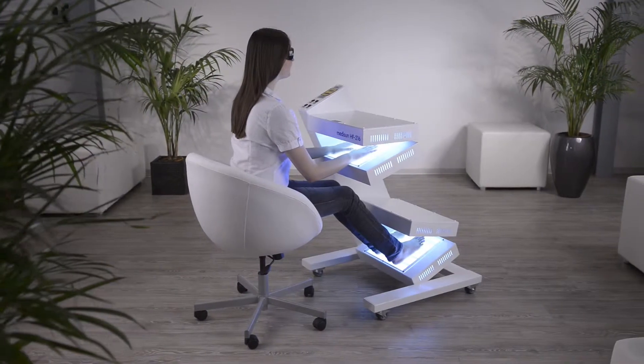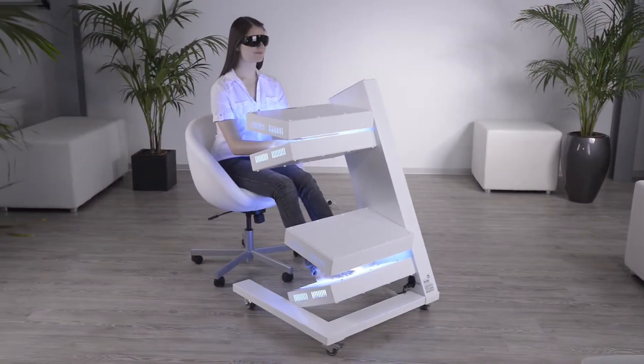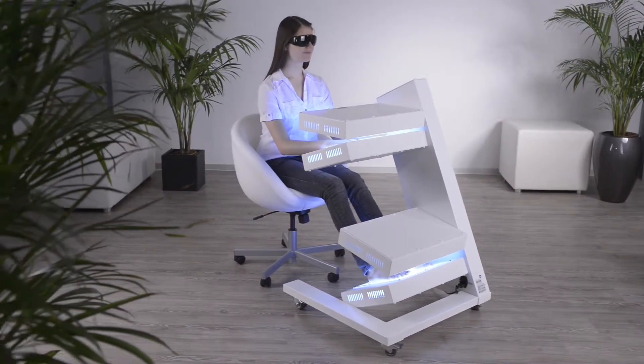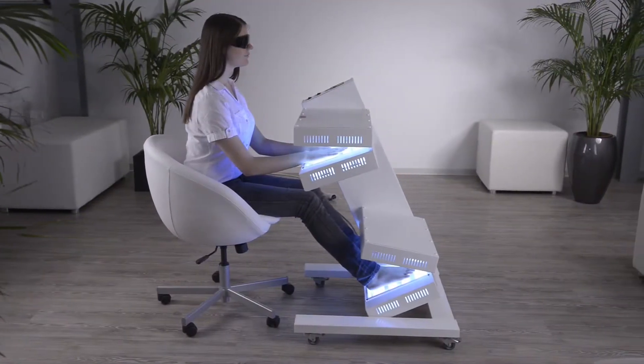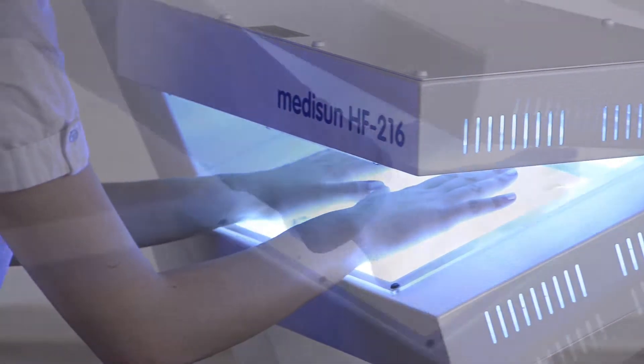MidiSun HF216 is available with two or four lamp modules in PUVA, UVB311, and in a combined version. This enables hand and feet treatment at the same time.